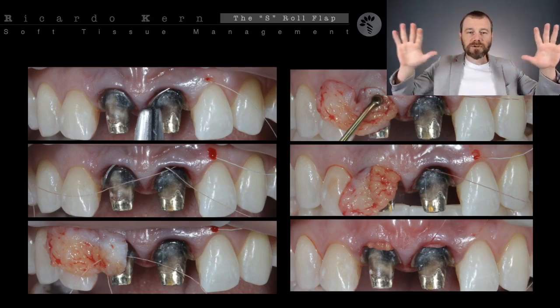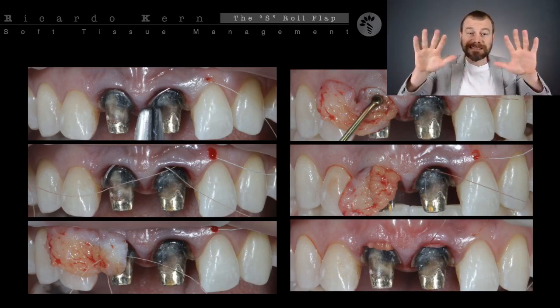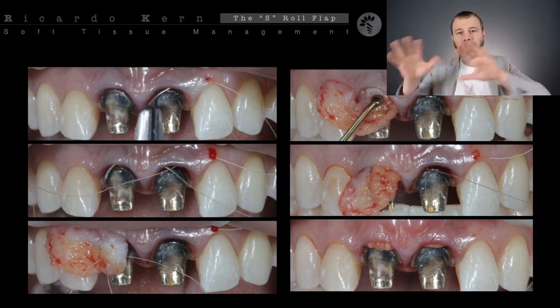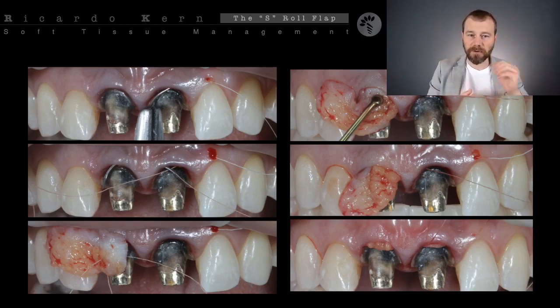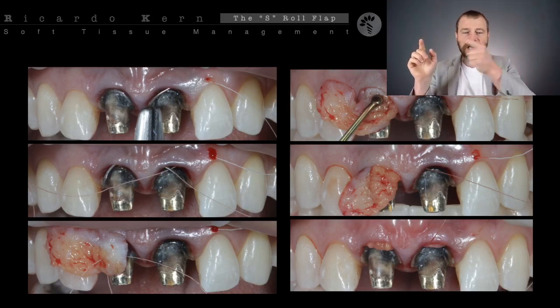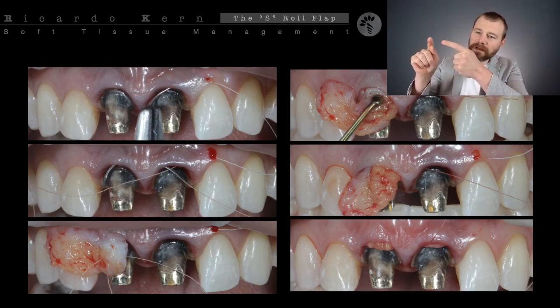If you have tunneling all around this area and the anchorage is on this flap that was released, which is movable, you are trying to fix something in something that moves, so it's not a rigid and stable anchorage point. And we have the tunneling area not larger than under the papilla. So we can check with a probe how long the tunneling went, and 1 millimeter away from that we can engage with the suture.